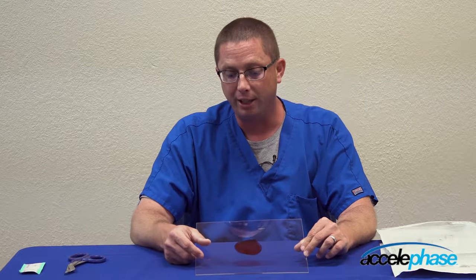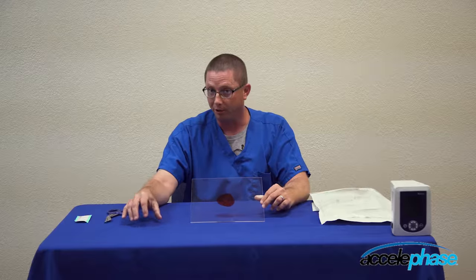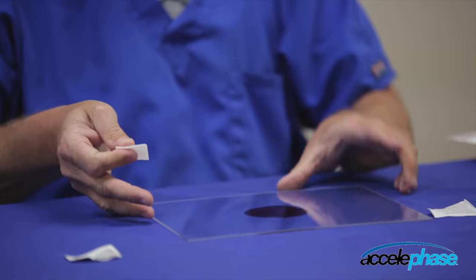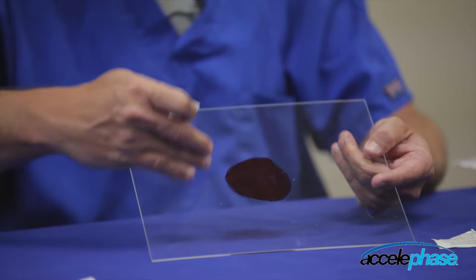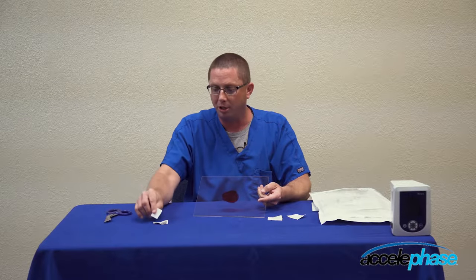Per your institutional guidelines, you would cleanse the wounds accordingly. From there, you want to assess the peri-wound area, apply skin prep around the peri-wound area, and you want to ensure that you go about one to two inches out from the wound into the peri-wound area to ensure that you apply protection.